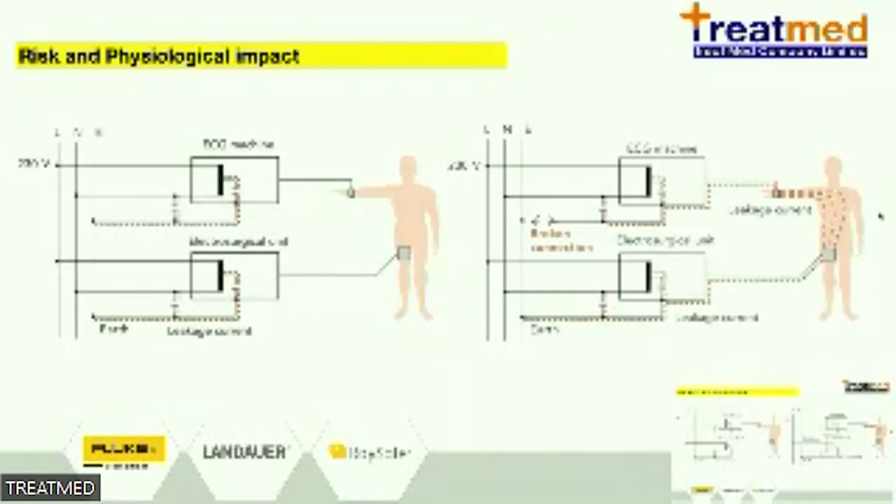This picture can cause the patient to be shocked, because the electric current stays on the human. When we attach the medical devices, the current passes through the human and goes to the ground. It can make the patient get an electric shock. This is a non-recommended system.